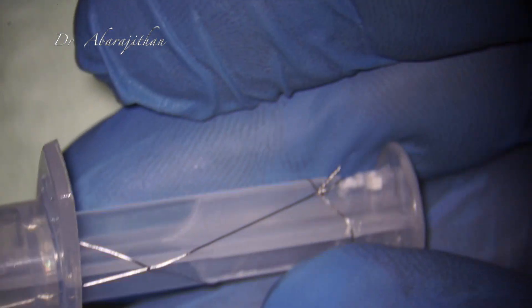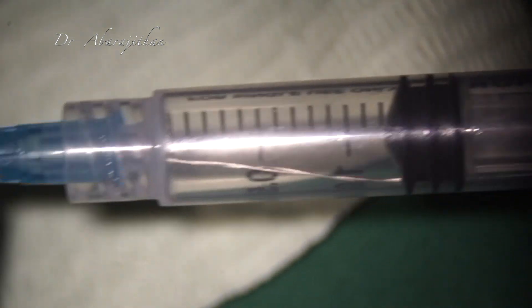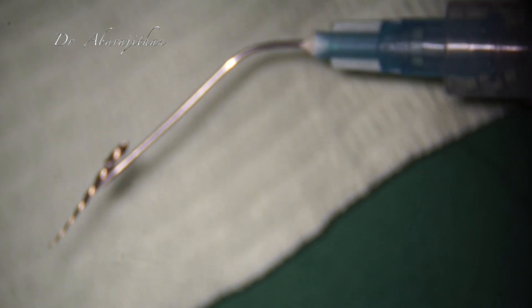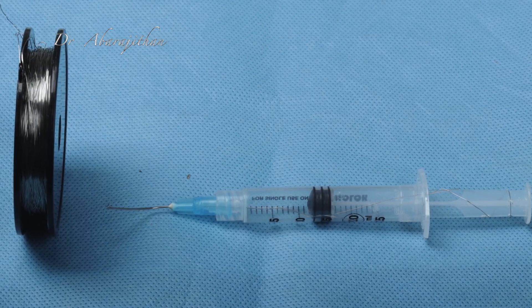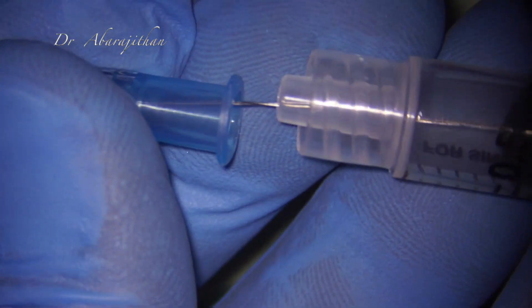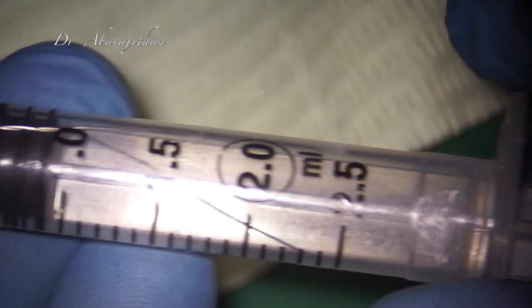This may look a little crude compared to the actual ICR version, but it may also work for instruments that are loose and in an accessible area of the tooth.